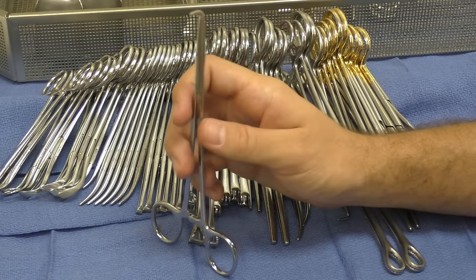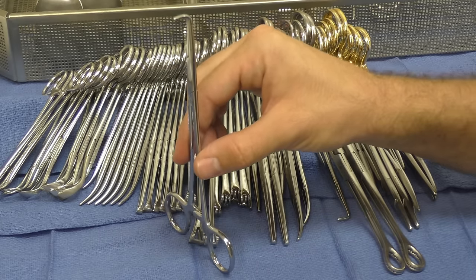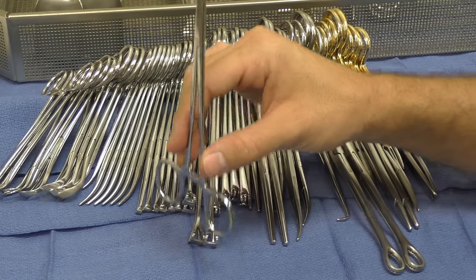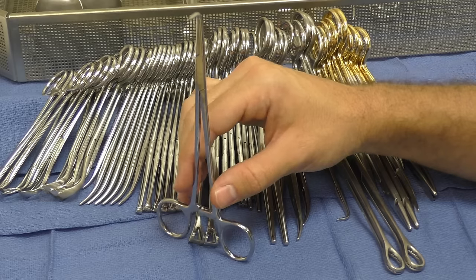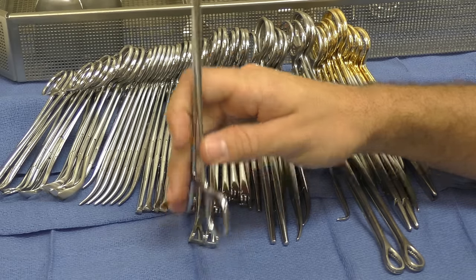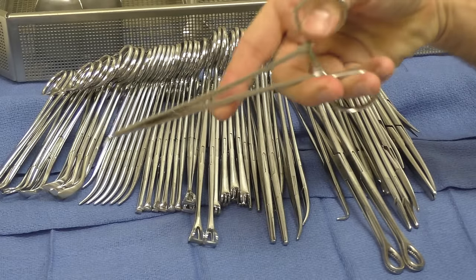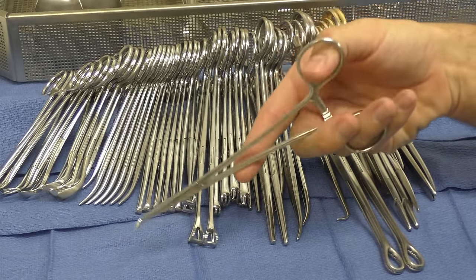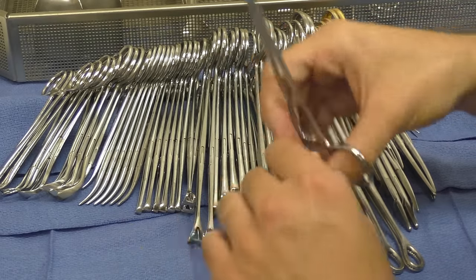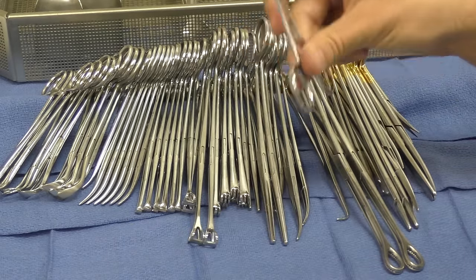But in the instance of the minor general tray, it could be used for dissection, and maybe if the surgeon is coming into a big vein that's kind of in their way, and it's something that they don't want to clip, they might go ahead and use this right angle to get around the vein, dissect around the vein a little bit, and put a couple ties around the vein and tie that vein off and get it out of the way.